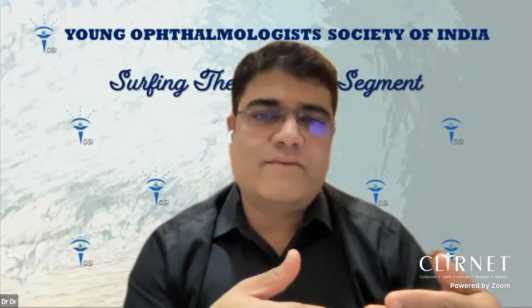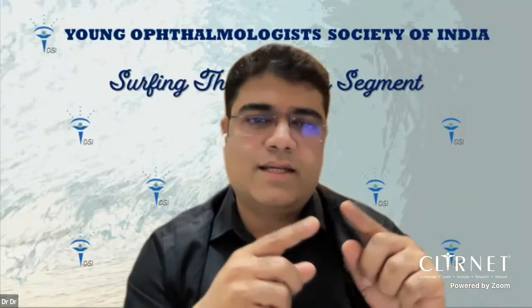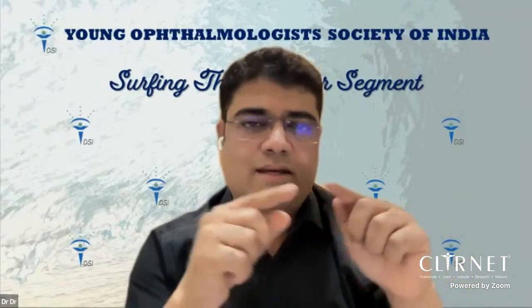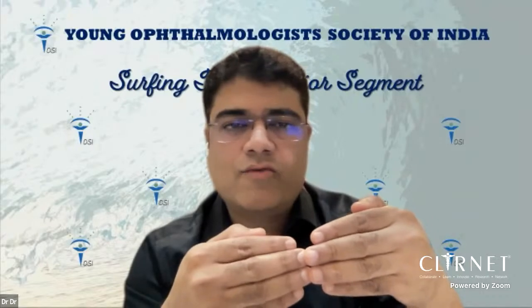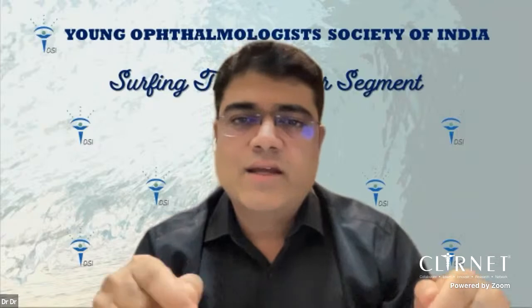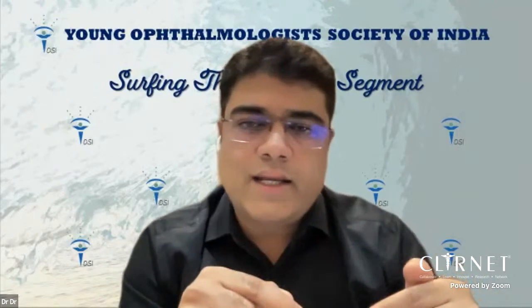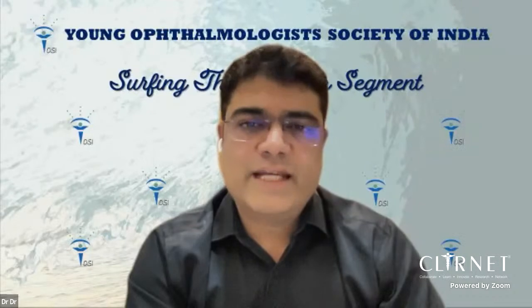See, in the first case which I showed, we can very well see if PCR is there, a lot of red glow is there, and a lot of vitreous is coming. So we have to put triamcinolone first, visualize whatever vitreous is there, do vitrectomy, and then try to take off whatever nuclear piece or cortex is there, because if you don't clear it off, it will cause traction on the vitreous. That will create problems.